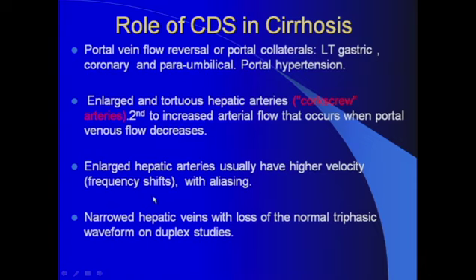Now, the next step is to look at the hepatic veins. Despite the fact that blood flow can still be preserved and going in the right direction, outside of the liver into the IVC, you need to evaluate the pattern of the blood flow. It's very important not to miss the color evaluation of these veins, to look again for aliasing. We know that in the abdomen, the veins are not supposed to have color aliasing, not supposed to have high frequency shifts, unless there is stenosis in these veins.